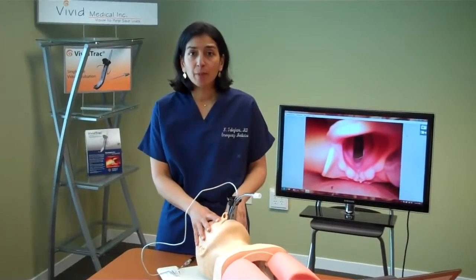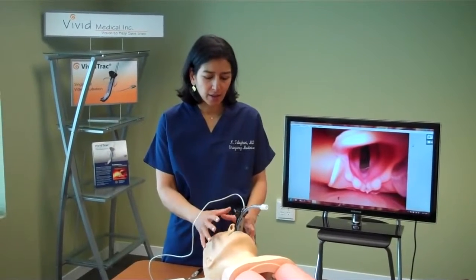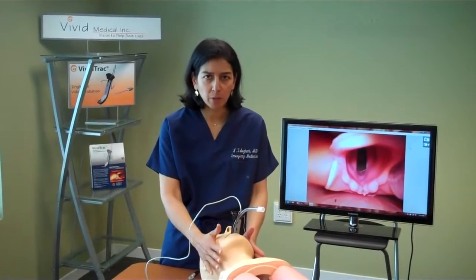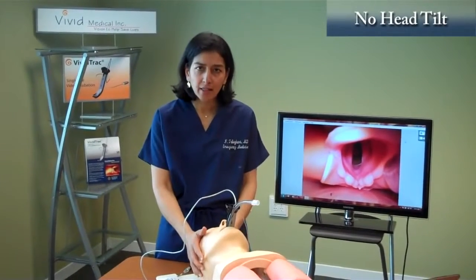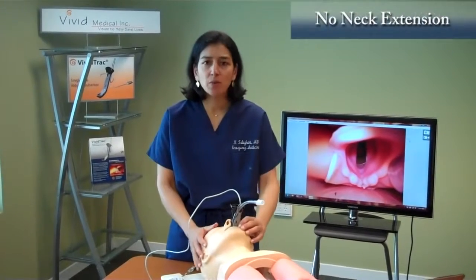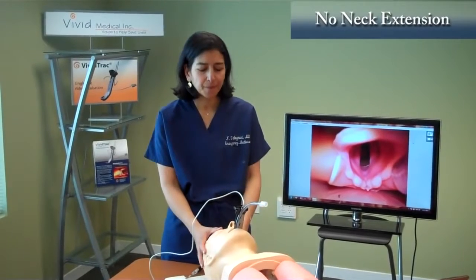So let me tell you about a couple of pearls and a pitfall. One of the first pearls is that this device can be used to intubate a patient who's in C-spine immobilization. You do not need a head tilt, you do not need neck extension, and the device will go in without any difficulty, and it's ideal for a C-spine immobilized patient.